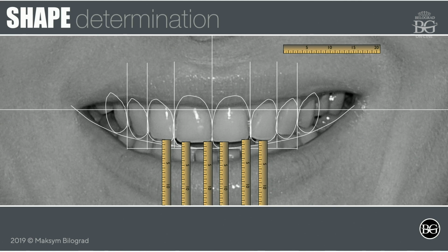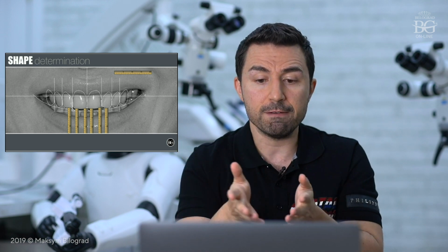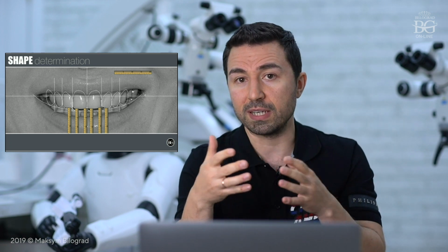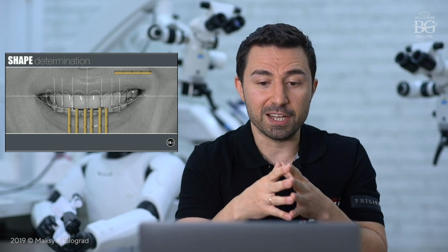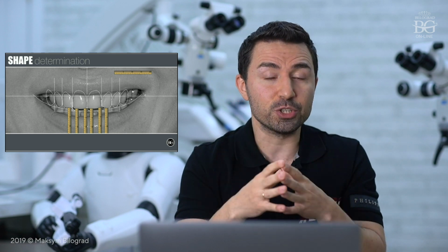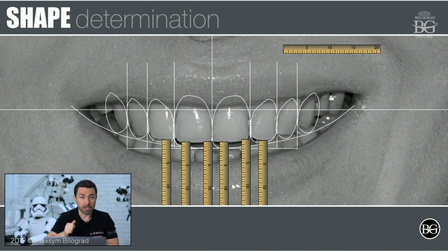By the way, when we use these templates, when we have these golden proportions and templates to understand the exact length of central incisors, it nowadays becomes really simple. Just imagine if you don't have any templates or guides, it's pretty difficult to decide whether to make this longer by 1 millimeter or 1.5 millimeters or maybe 2 or 3. But now we can do everything just by analyzing a picture within a few minutes, and we will get a guideline for ourselves and for our dental technician to follow the other steps to complete the aesthetic and functional rehabilitation in this case.